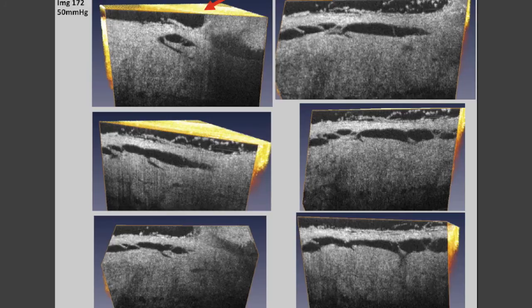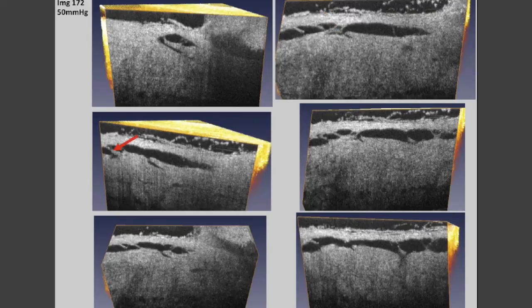We can rotate this axis in any plane so we can go through the planes in any dimension. By taking advantage of this tilt and turn, we can optimize the image so that we see the trabecular meshwork, Schlemm's canal, collector channel entrances, and hinged scleral flaps at the collector channel entrances. Each of these images has been optimized to see these hinged flaps which seem to be present at every collector channel entrance.